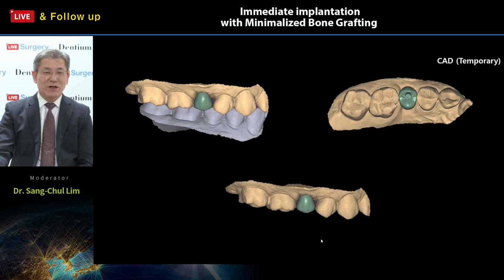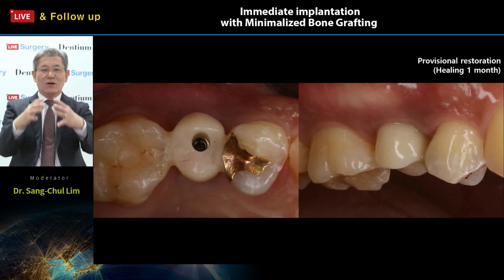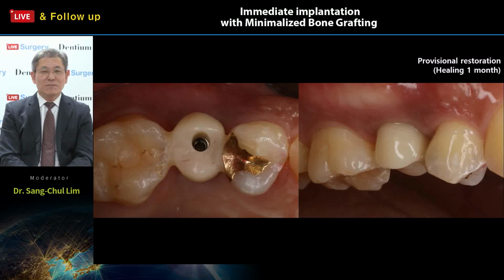And the CAD temporization, we try intraoral scanning. These PMMA temporizations connect with the just-scanned digital abutment, right? On top of the digital abutment, the designed and milled PMMA temporary abutment connects with the top of this digital abutment, and then cementation with temporary cement, or resin splinting like this is also available.